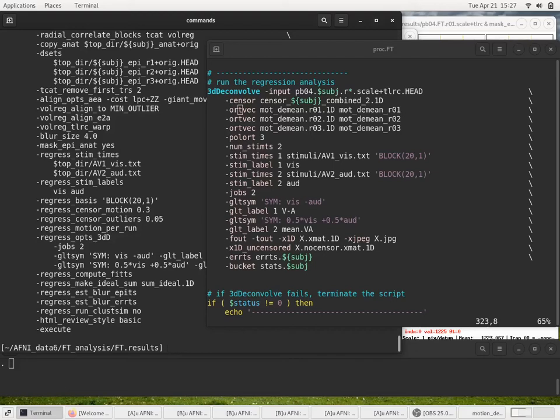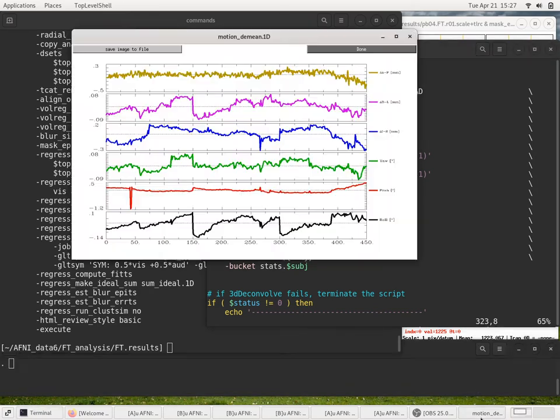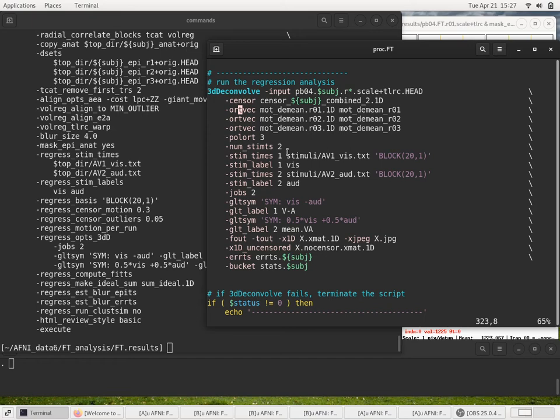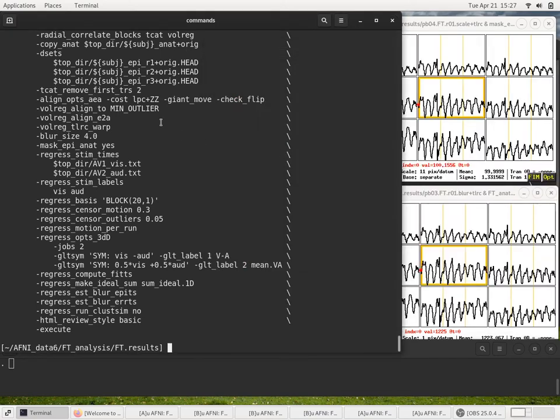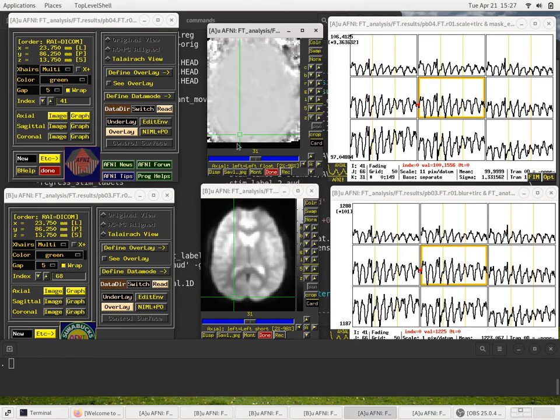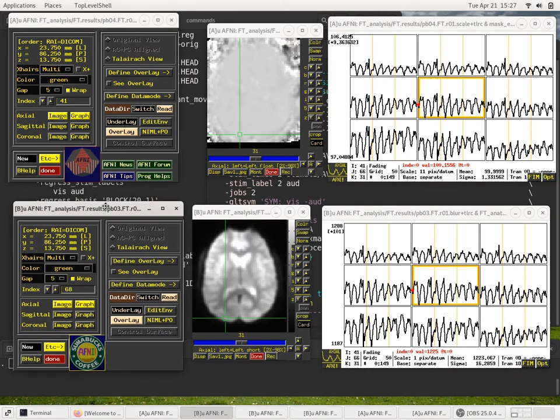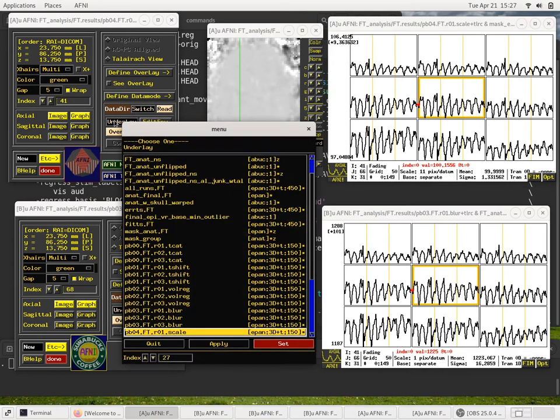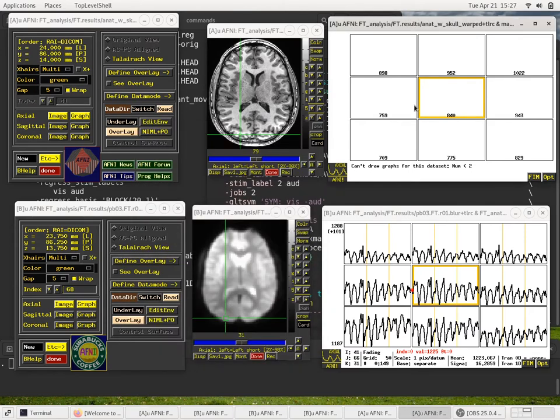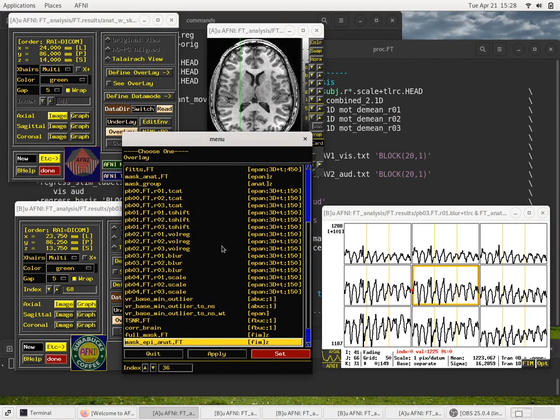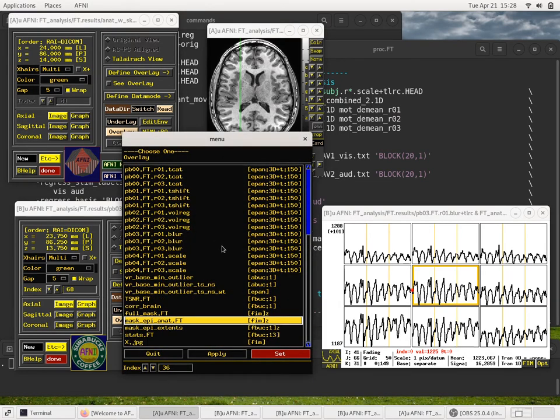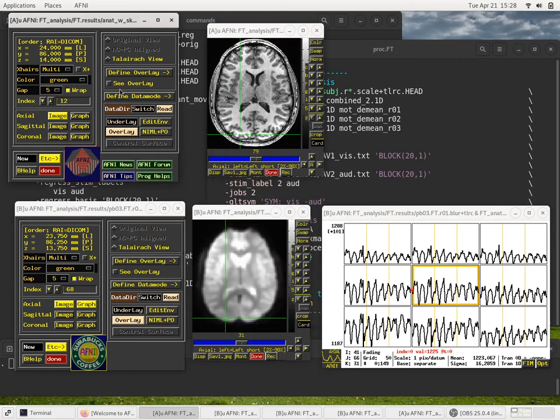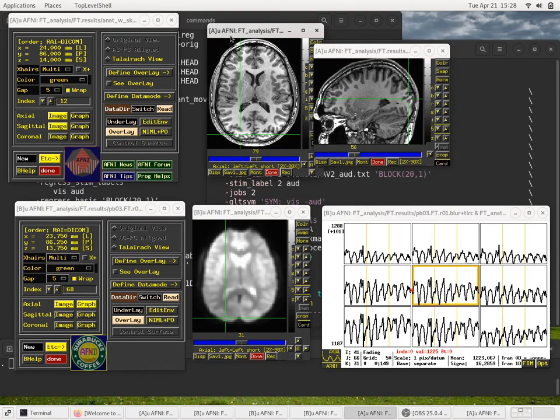So now that we have gone through the 3DDeconvolve command and understand the model, I see I have some extra stuff still plotted here. Let's actually look at the results in AFNI. So I'll just lower these windows briefly and we see absolutely nothing. Maybe there is no activity. Let's open a couple of windows.